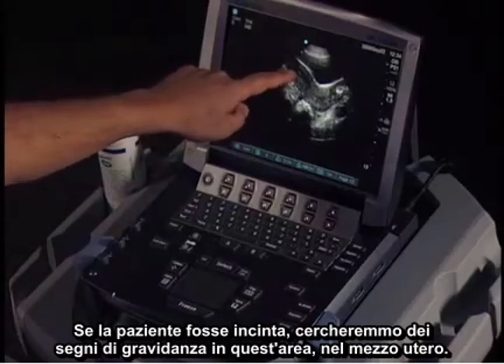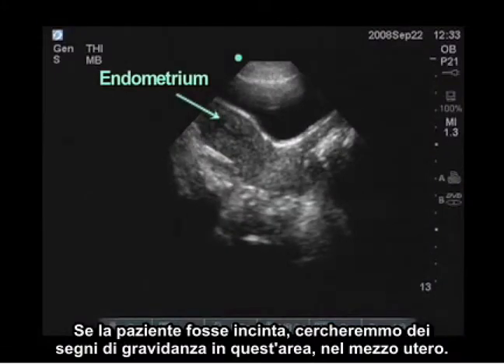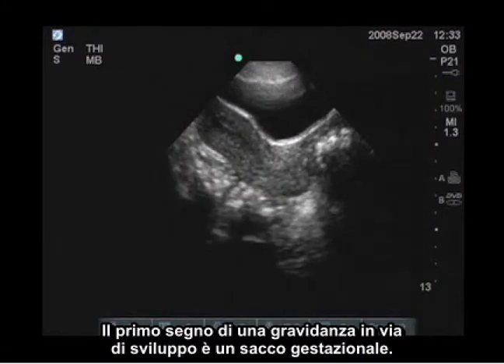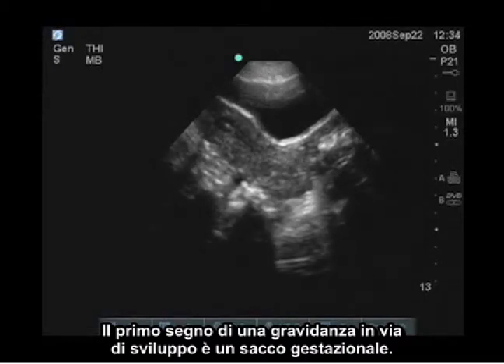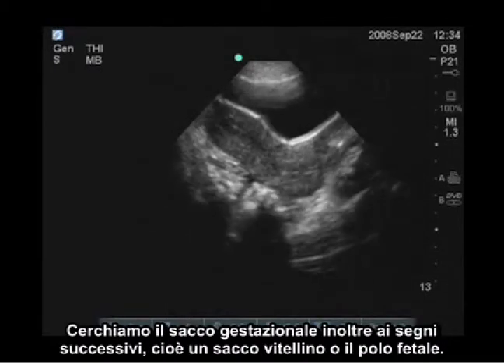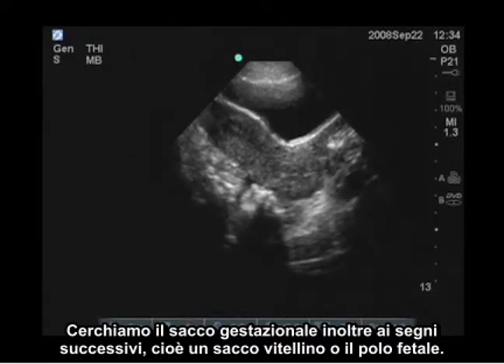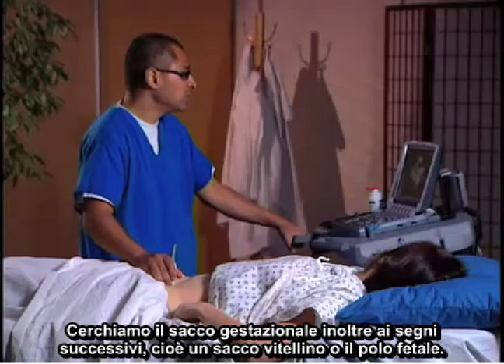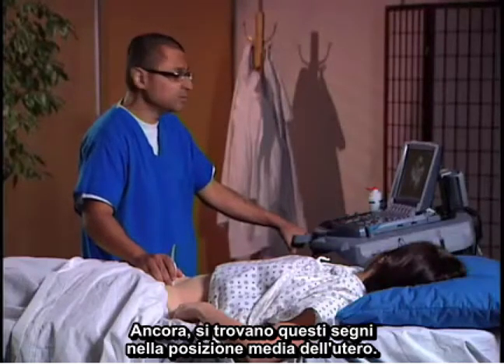If the patient is pregnant, we would be looking for signs of pregnancy within this area — within the mid-uterus. The first sign of a developing pregnancy is a gestational sac. We're going to look for a gestational sac, as well as the next subsequent signs, which would be a yolk sac or a fetal pole. Again, these would be located in the mid-uterine position.